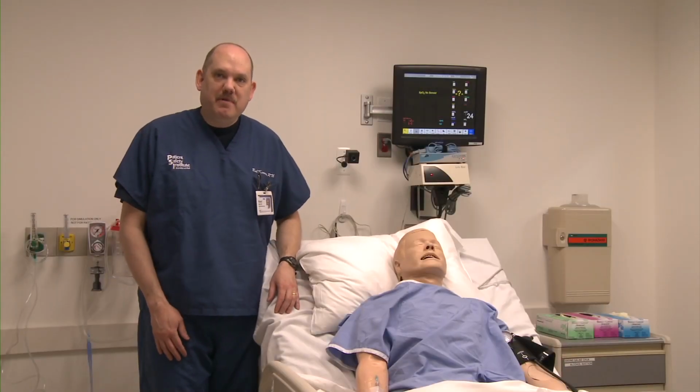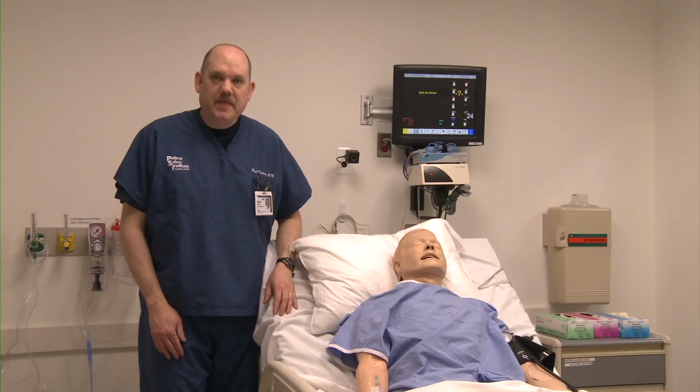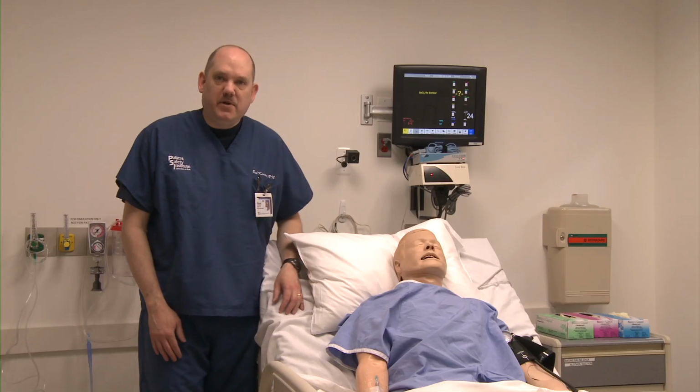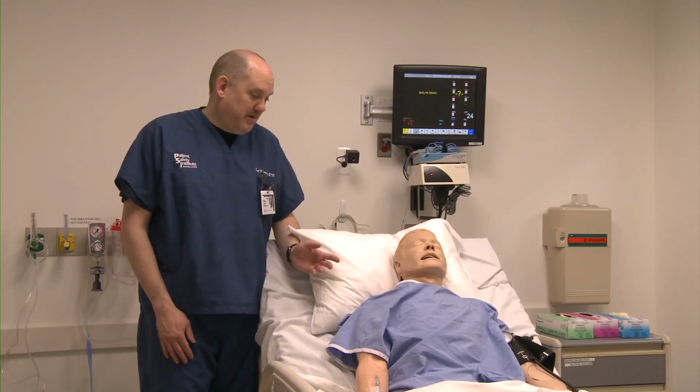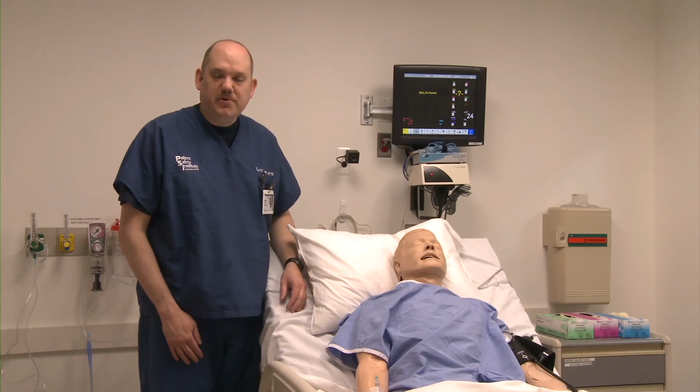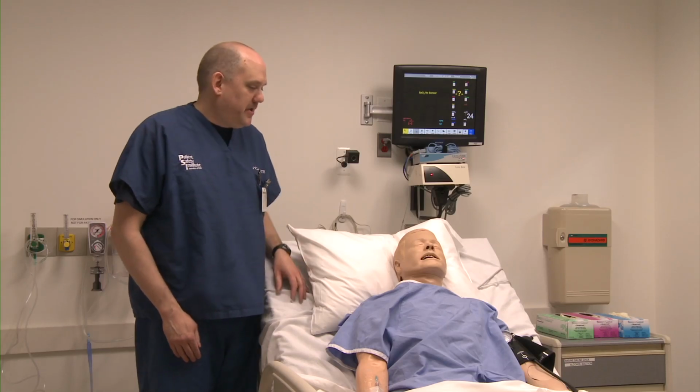I'm one of the faculty members here at the Patient Safety Institute. In the next few minutes, I want to introduce you to SimMan, one of our high-fidelity patient simulators. The purpose of this introduction is to familiarize you with the technology in use so that you can get the most out of your visit here. Let's start at the head.